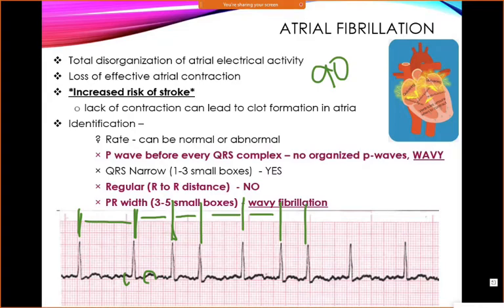And no P wave that I can tell, we're going to call this one fibrillation. And the reason we call this fibrillation is because that's exactly what the atrium is doing. There's no nice P wave, okay? Don't spend a lot of time on an irregular rhythm. Don't spend a lot of time looking for that P wave if it doesn't exist. This is a fibrillating atrium.